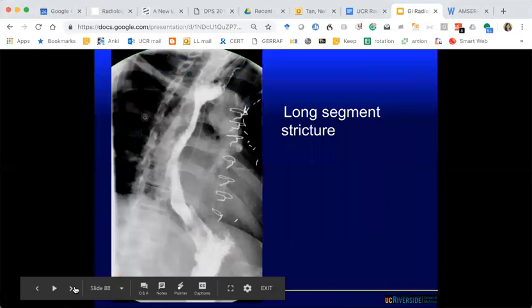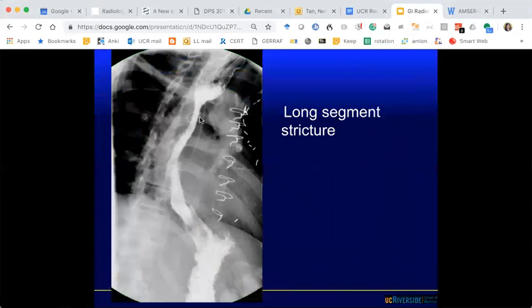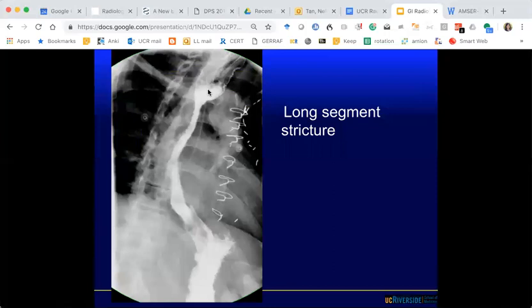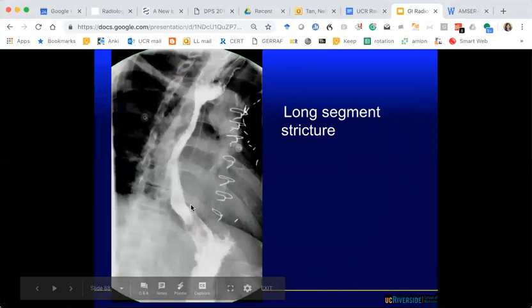Here is an example of a long segment stricture — this is normal esophagus that's open, and here it's fixed. You can get that in people with prolonged NG tube placement — this is why you shouldn't give an NG tube unless needed because it can cause strictures. Also from patients who ingest lye to commit suicide, radiation therapy, or anything that causes long-segment irritation.